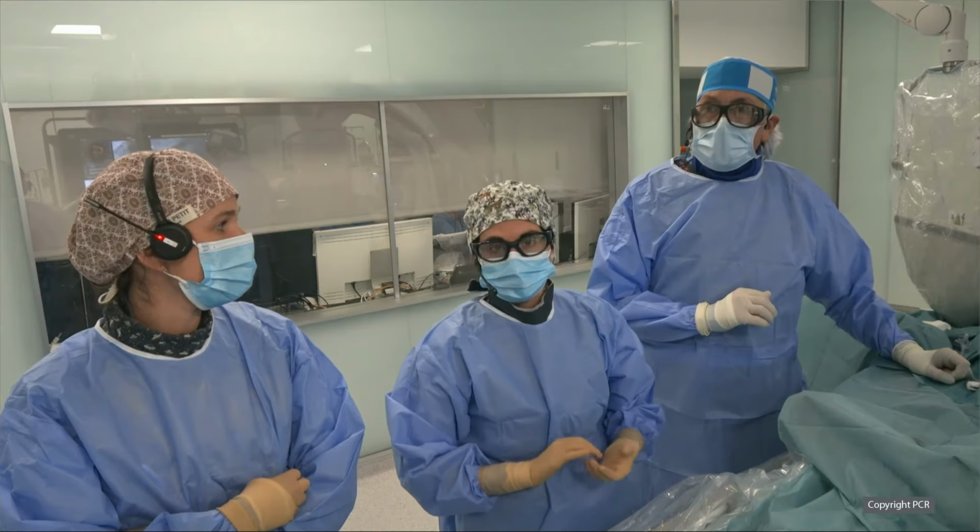Now, I'm going to hand it to Nieves, because now you will see the possibility of correlating what we have found with the findings that you have with OCT. So maybe first you can explain how was the wiring? That was one actually of the concerns at the beginning of the case, how easy was it going to be to cross this lesion with the wire.